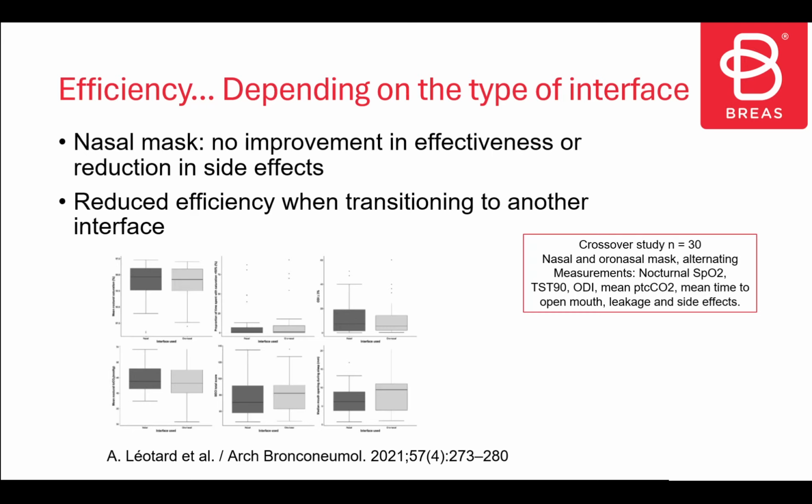He found that regardless of the mask, whether it's a nasal mask or a face mask, there was no impact on effectiveness or reduction in side effects. On the other hand, what he is saying is that when you make the transition from one mask to another, at that precise moment in that week, it can have a slightly reduced effectiveness. So you have to know that when you change your mask, the following week, the effectiveness can be impacted.